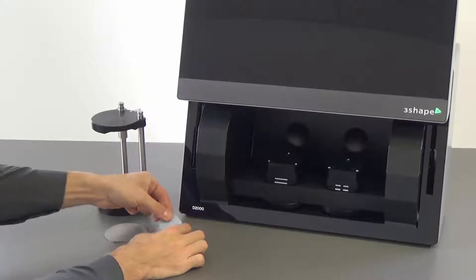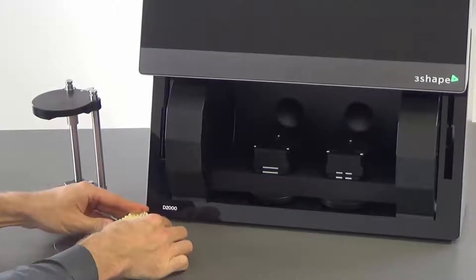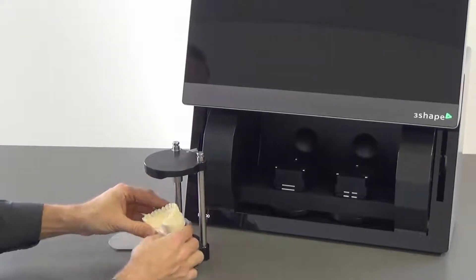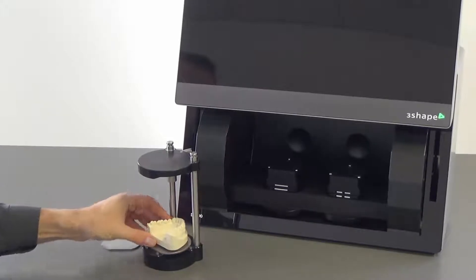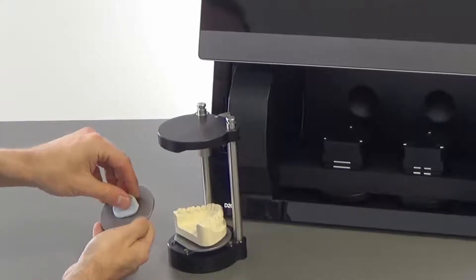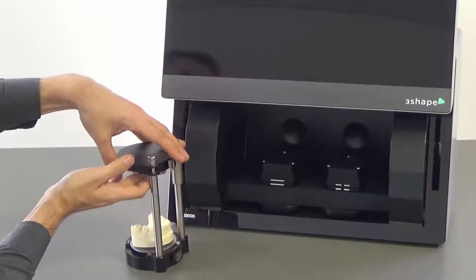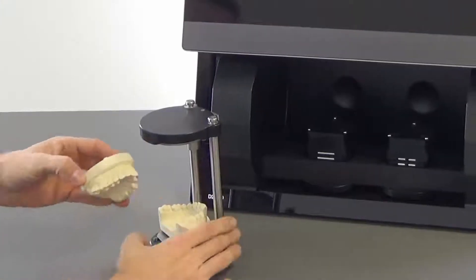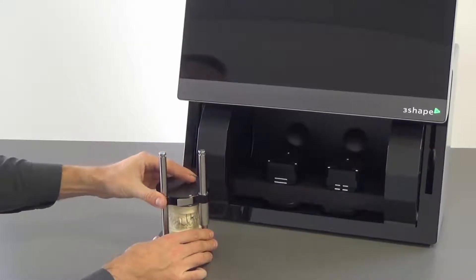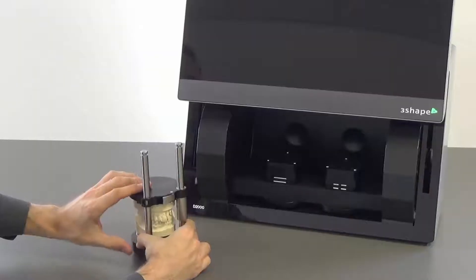When the Occlusion Setup Tool interface plates have been calibrated, you can start scanning models. Start by setting the lower model on the interface plate, then insert the plates in the Occlusion Setup Tool between the three alignment points. The flattened edge should be facing outwards. Lock the plates using the locking mechanism. Now position the upper model on the lower in the correct occlusion and close down the Occlusion Setup Tool. The occlusion has now been set.